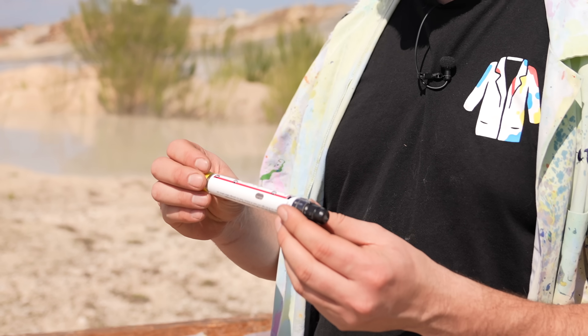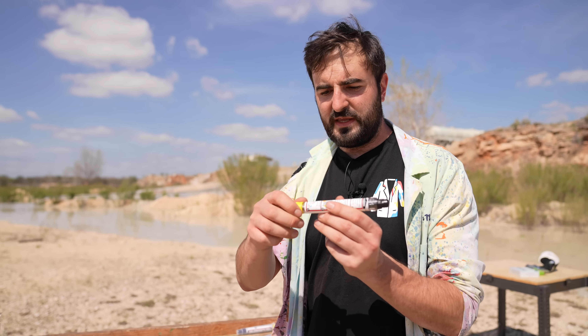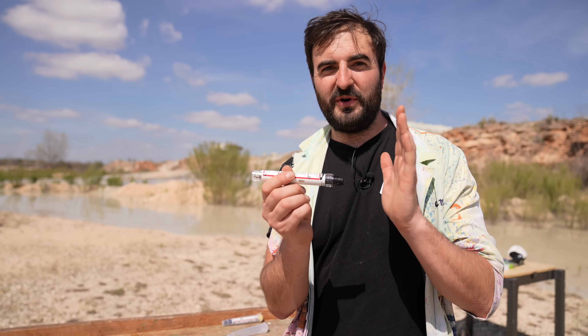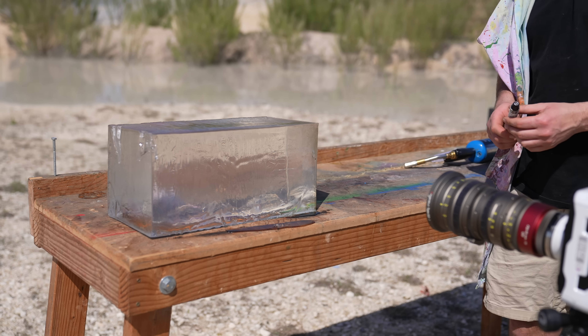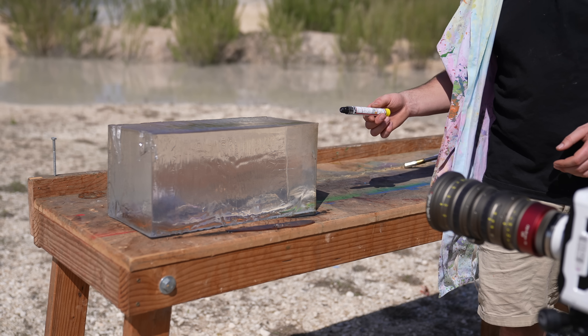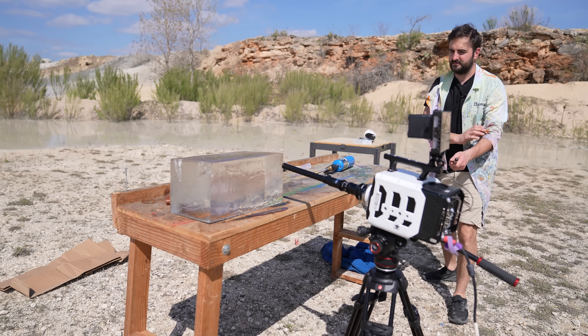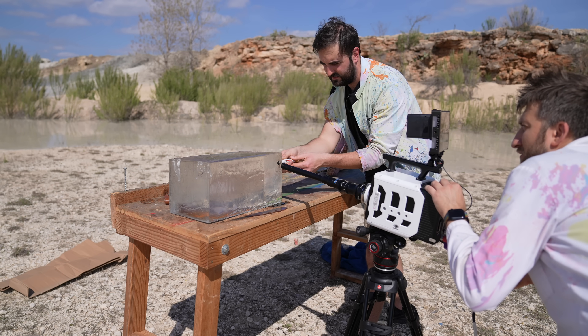All right, here's a little ballistic gel set up. Have you ever used one of these before? I haven't, thankfully. I know that my mum has used them, but the instructions are pretty simple: take off this outer sleeve, remove the yellow cap, and then — I'm not going to do it — but you push at 90 degrees for like 10 seconds and that injects the juice. I've actually got no idea how far in this will go or how hard I'm going to have to push it, because a thigh is a lot more solid than this gel. All right, probe is on. Let's get real close up. Go for it.